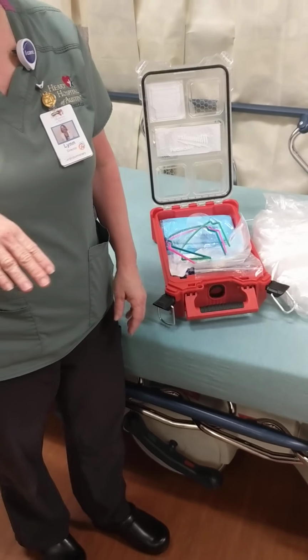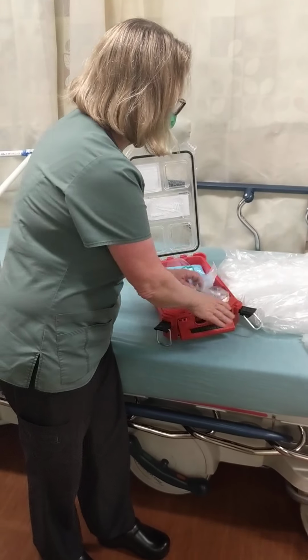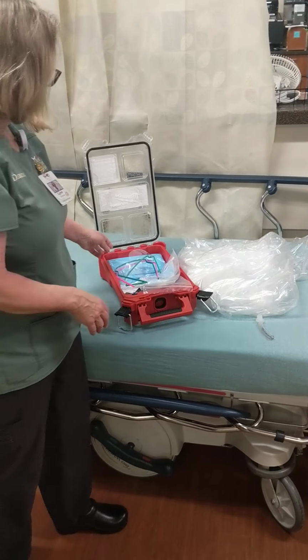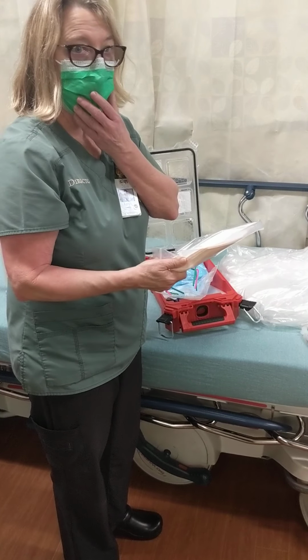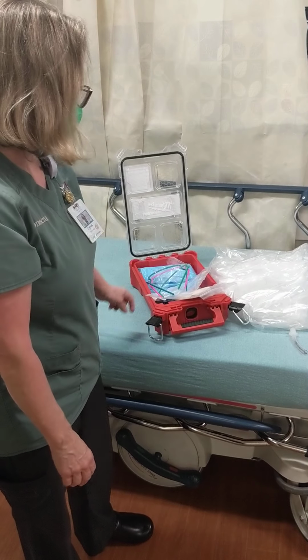We're going to keep the glide scope covered all the time anyway, but in case you need one, there's a plastic cover here. There's our plastic cover for our patient. Our team right now is putting on their N95 masks, but as we conserve masks, we're just going to wear the mask we're wearing currently. We'll put on our gown and our gloves.